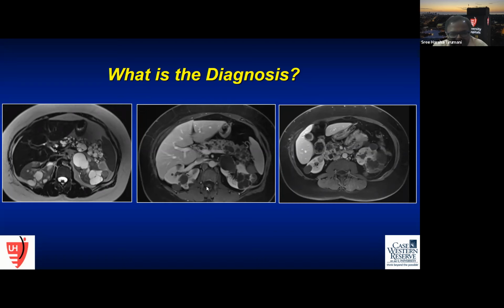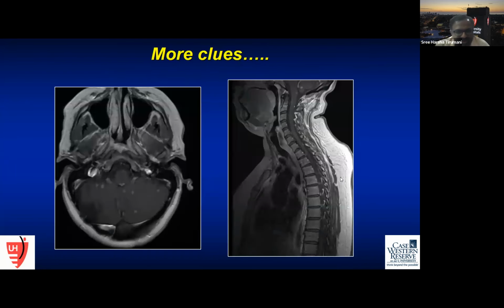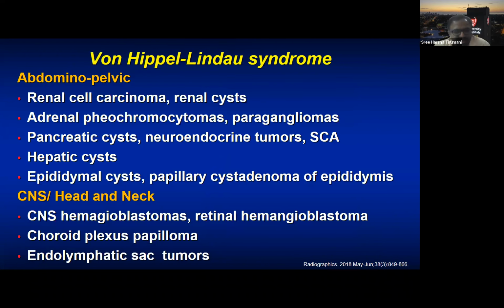Ishwar sir. You're right, sir. So the finding is that on the post-contrast images, you see some solid renal masses. This patient also incidentally has a brain MR and a spine MR, which show these tiny dots. And these tiny dots are nothing but hemangioblastoma. So this is a case of von Hippel-Lindau. Sometimes we tend to see these cases once in a while, not very common, but when we see it, it's usually a nice case for the residents to look at all the head to toe findings in von Hippel-Lindau, and it's a nice teaching case when it happens in the reading room.